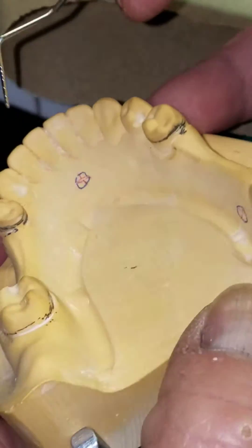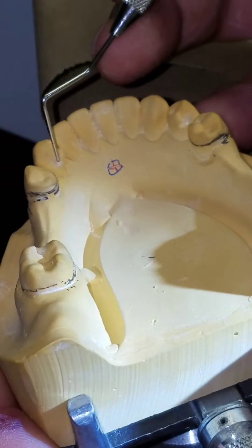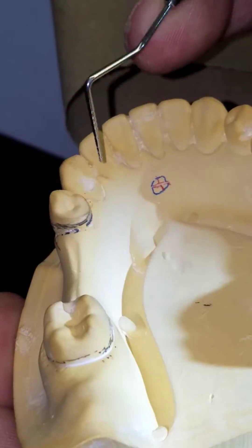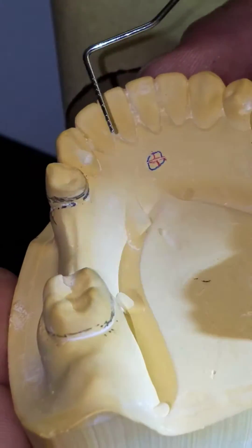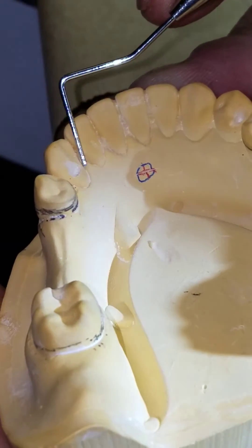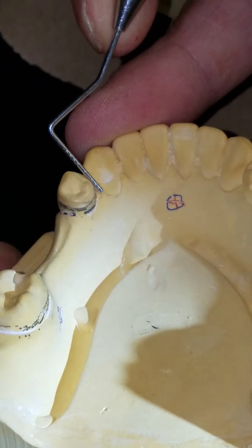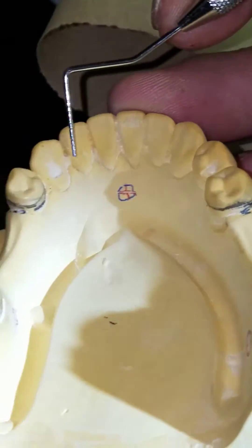Now I've got some resistance. This is just roughed out — I'm not quite done yet — but I'm getting a little resistance and that's all I'm looking for, just a little resistance. Next thing: you're going to widen it. So you go from line angle to line angle, so I can make that actually a little bit wider.